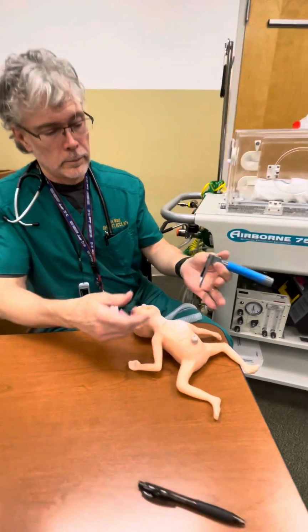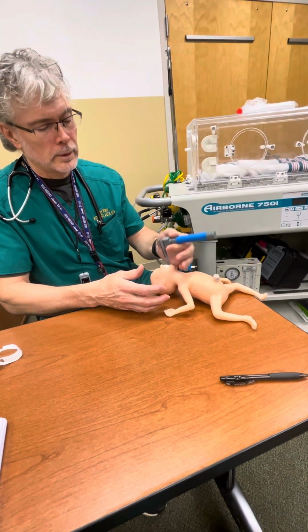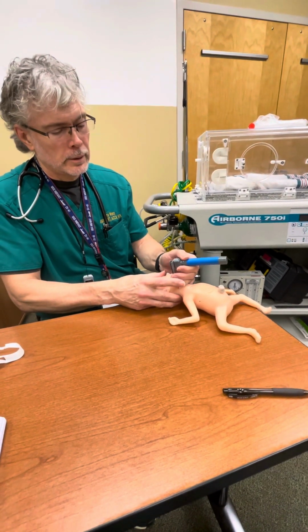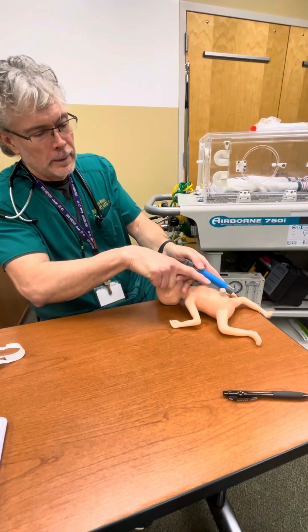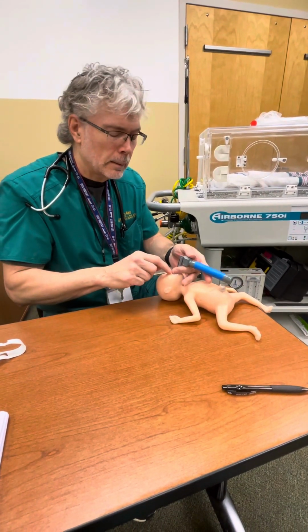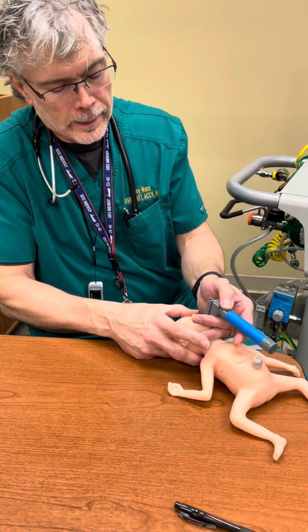You know, of course, when we intubate, me and Tiffany were talking about it. I like to choke down the tube, put a little pressure on the throat at the same time as I'm inserting. My hand's coming toward the baby's head, say like this. You see that? Now I'm aiming down as I go in. You want to aim the laryngoscope down to prevent damage to the upper palate. So you want to aim it down. Aim down, choke down on it, very gently insert like that.